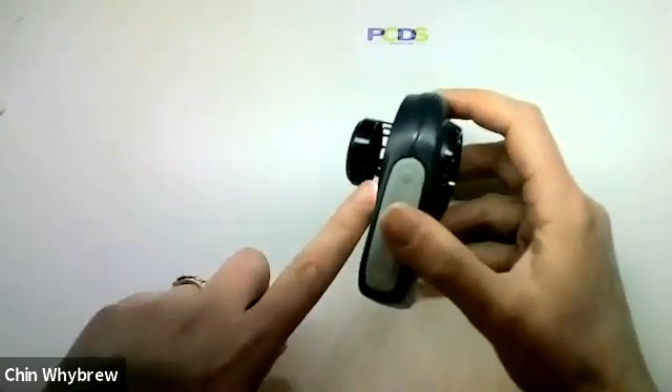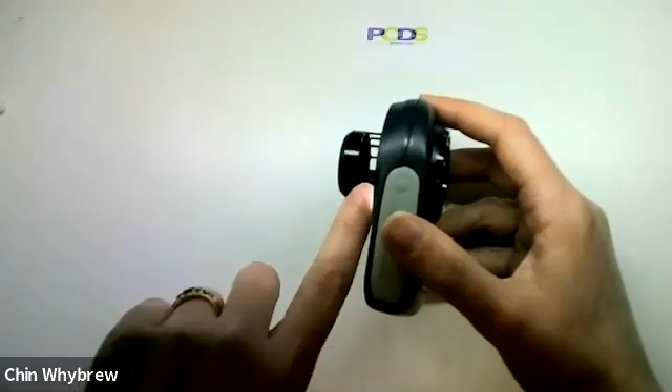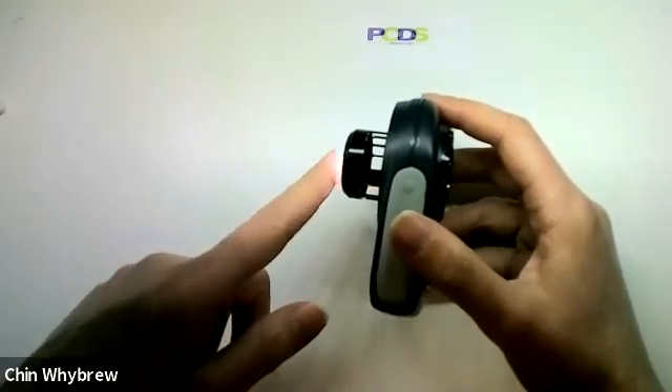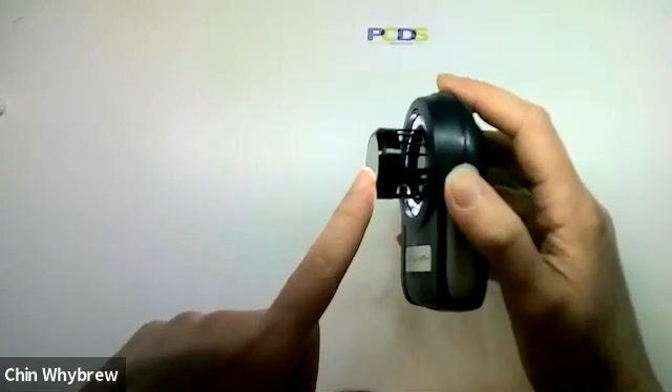What you'll notice with this one is that the end plate comes out on these plastic legs — lots of plastic legs and lots of holes in between where dust can get in. And so you can get dust quite easily on the inside of the end plate.